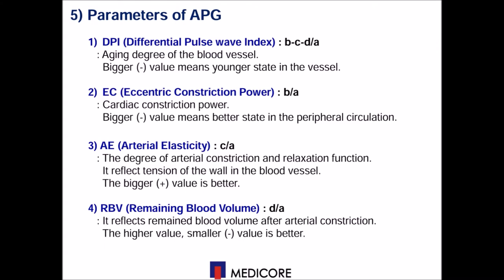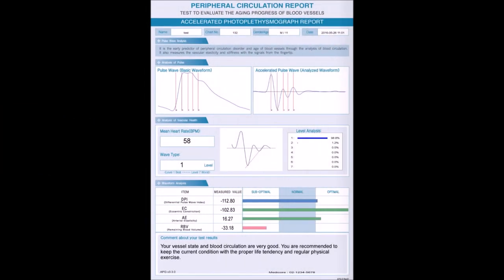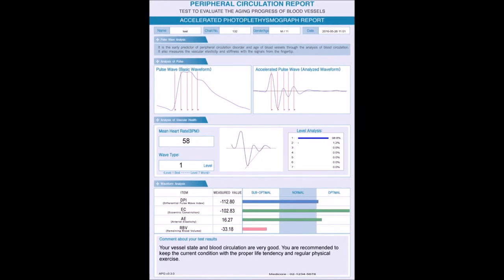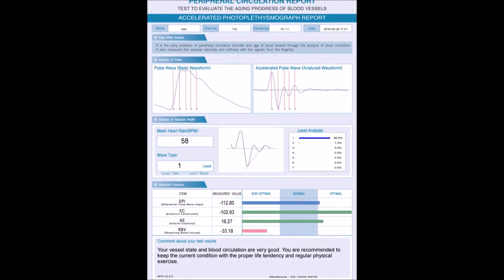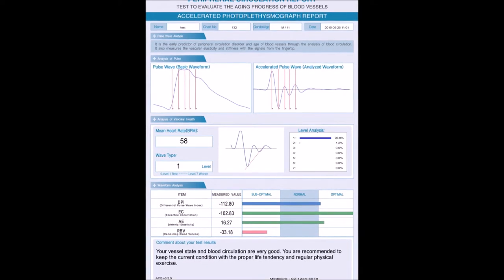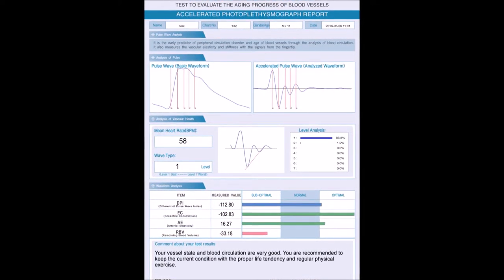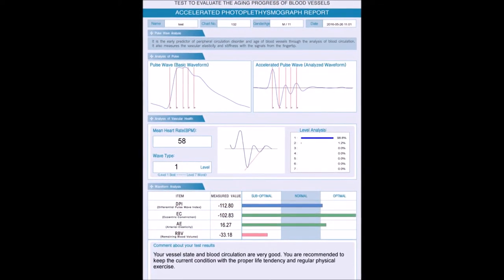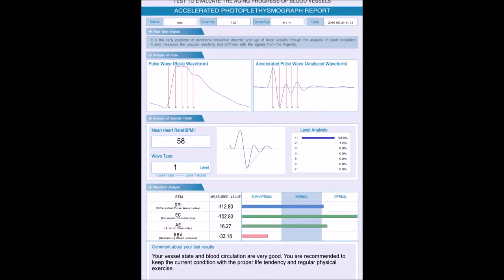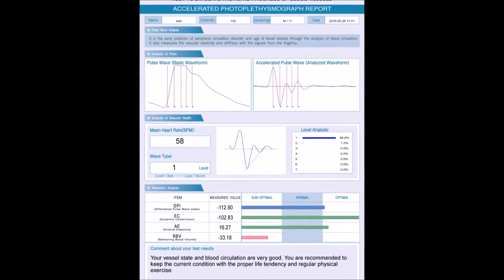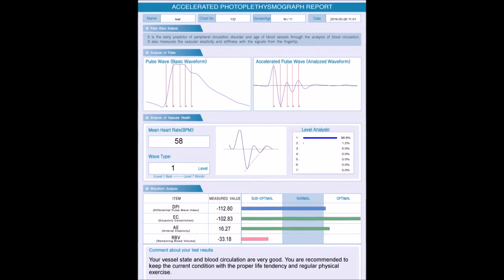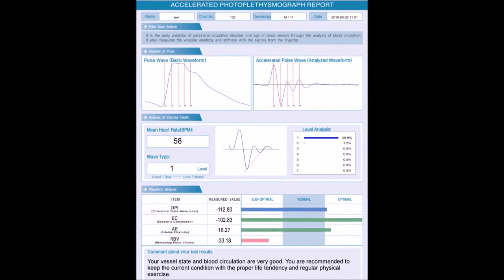Less remaining blood will be much better. Therefore, you can evaluate the total blood vessel status with the type. On the APG report, there are a total of four parts: wave analysis, vascular state analysis, results of each waveform, and finally, automatic comments on the result. We had all clinical research done, so it is very accurate and reliable.